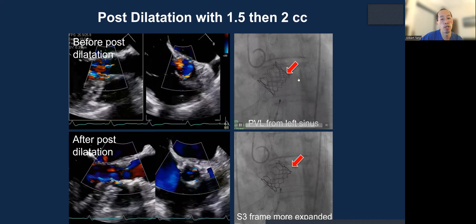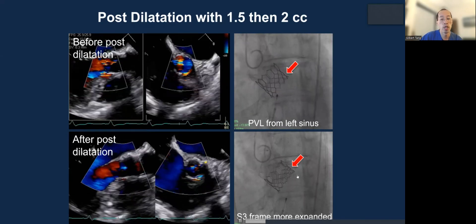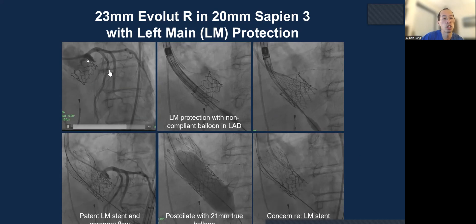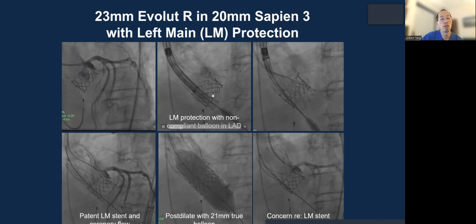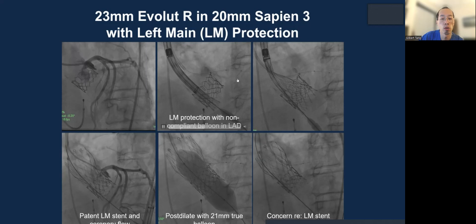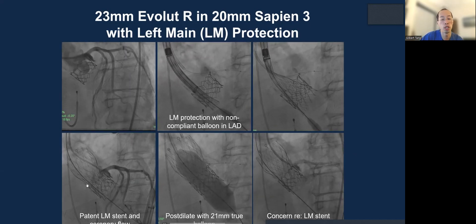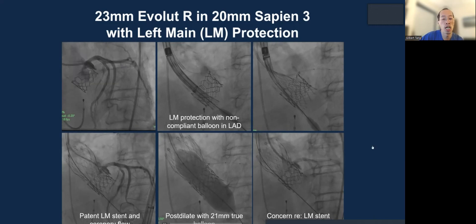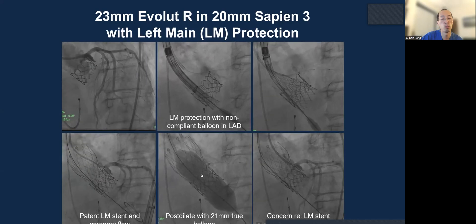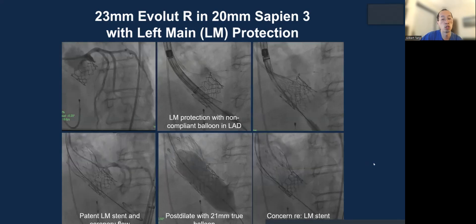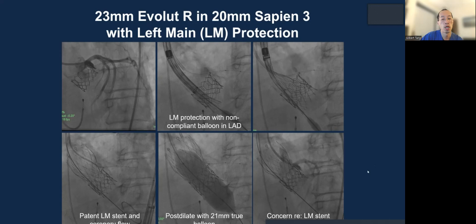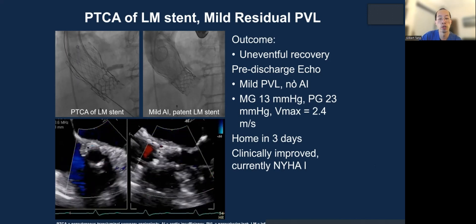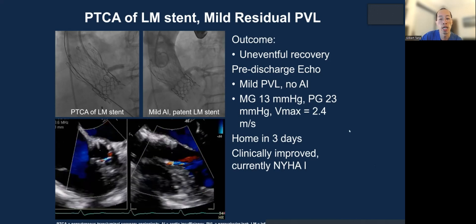Before post-dilation, severe PVL was present. After post-dilation, the Sapien-3 was better expanded fluoroscopically, but central aortic regurgitation developed. Because of this and left main obstruction risk, we used a 23 Evolut valve — self-expanding for better hemodynamics — to address the central AI and protected the left main just in case. After valve implantation, the left main remained open. We post-dilated to maximize Evolut frame expansion for hemodynamics, durability, and to prevent frame-to-frame leak. The left main stem remained patent, and we also ballooned the left main stem as a precaution. The patient now has at most mild PVL, no AI, good hemodynamics, and is clinically improved.